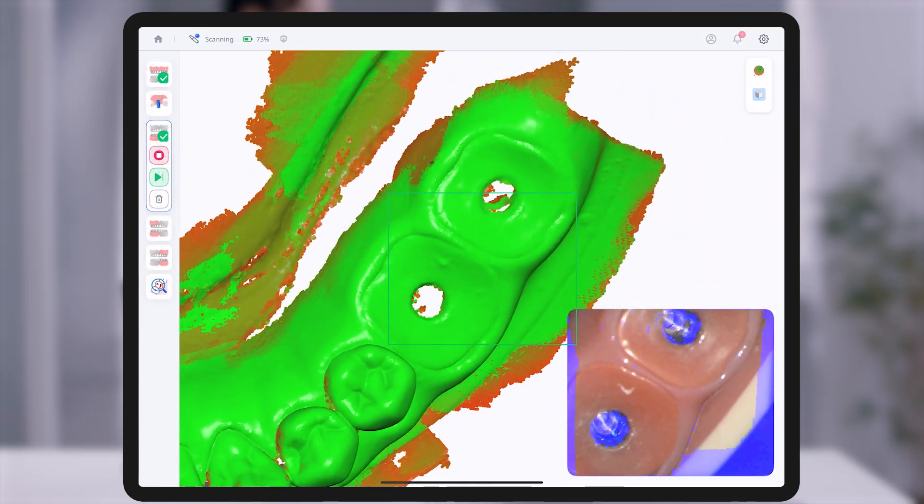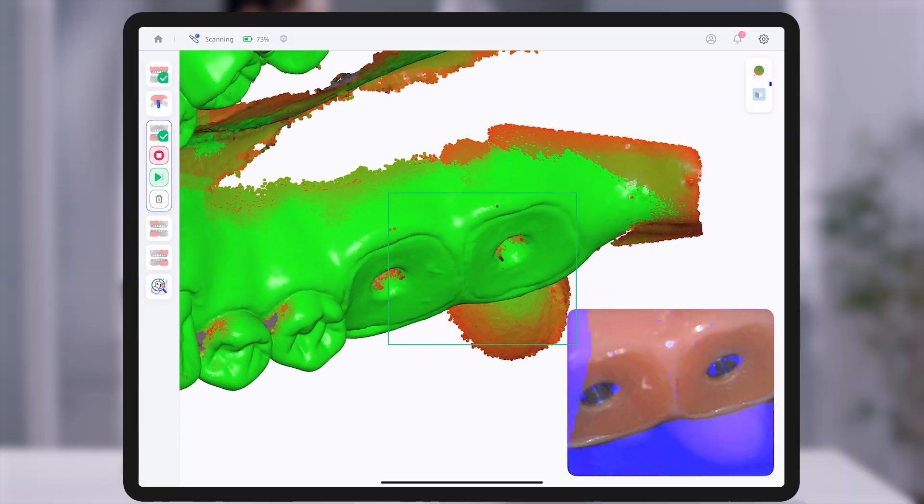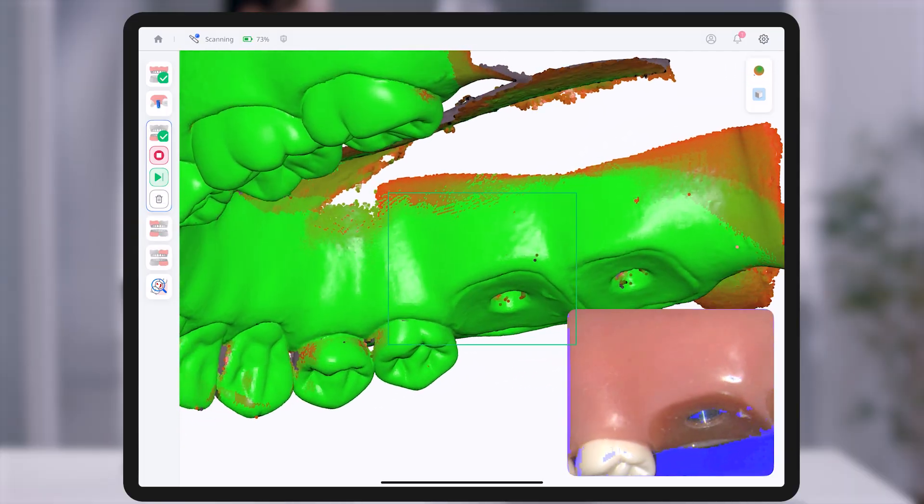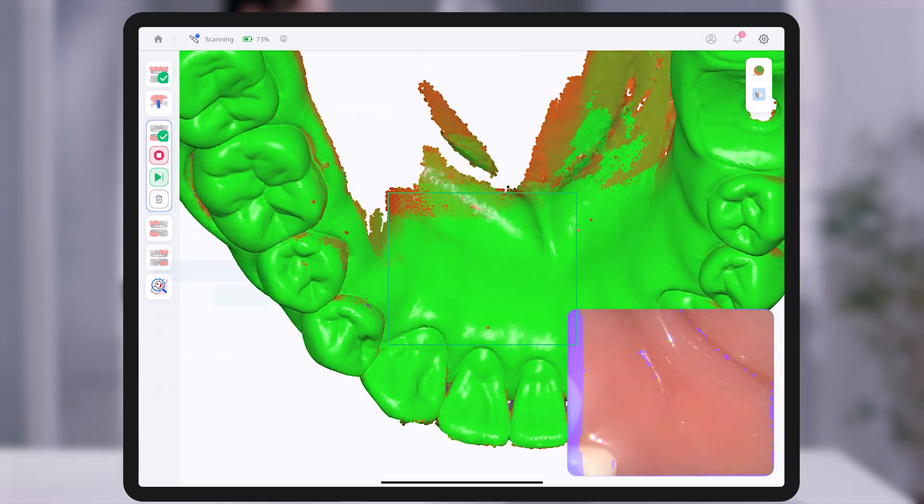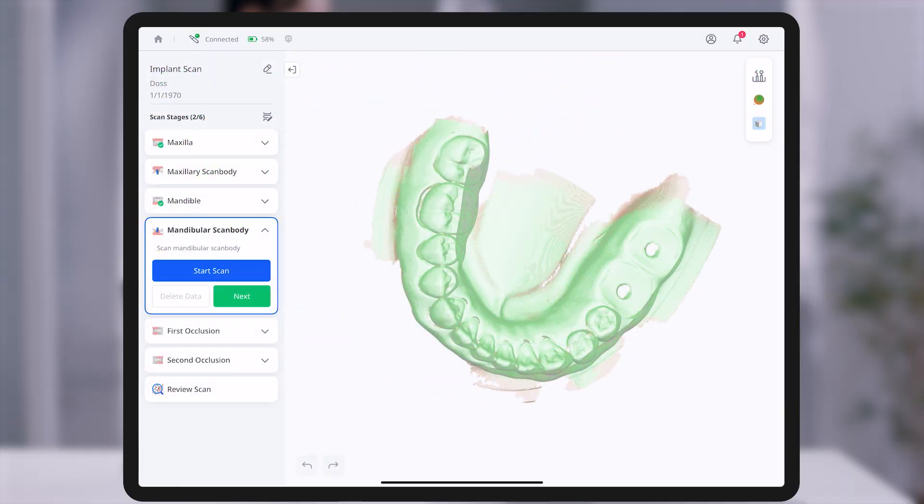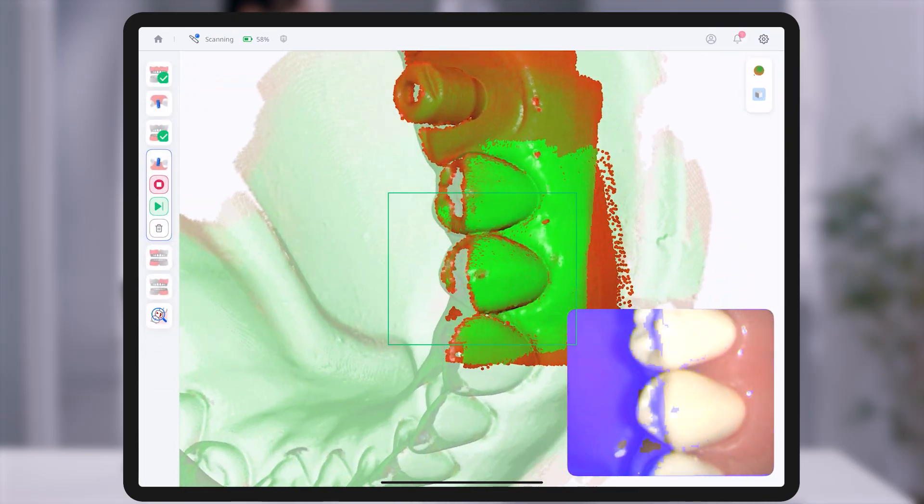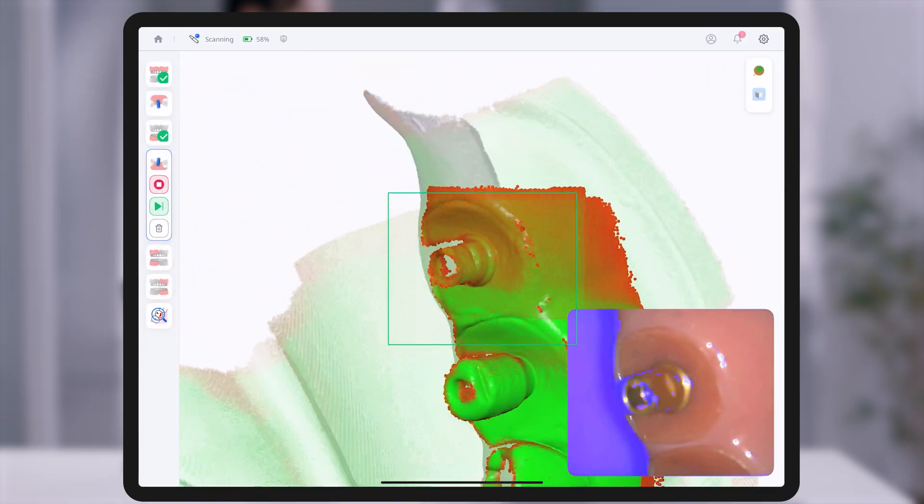During scanning, the reliability map allows you to visually assess the reliability of scan data through color indicators. Green indicates areas with sufficient data, while red highlights regions that require further scanning.